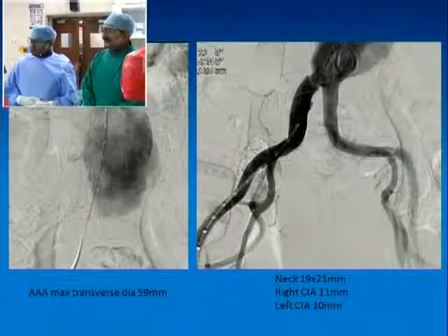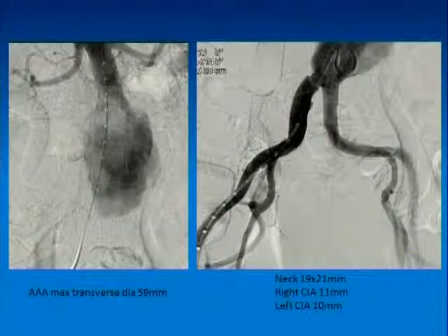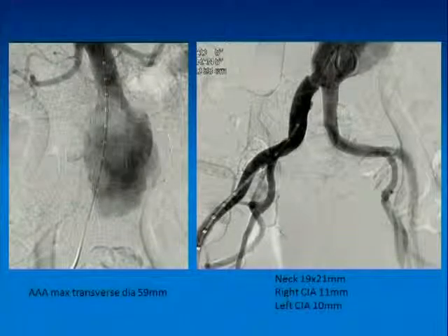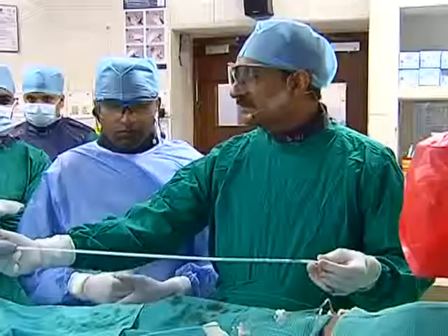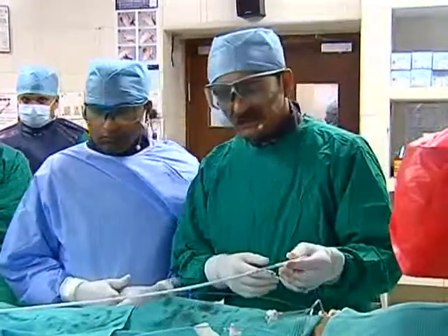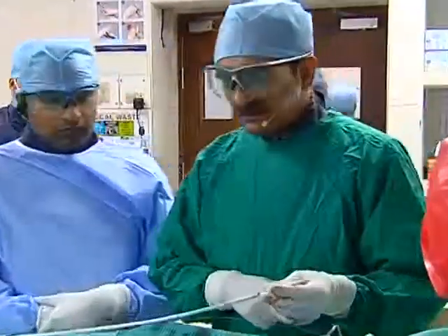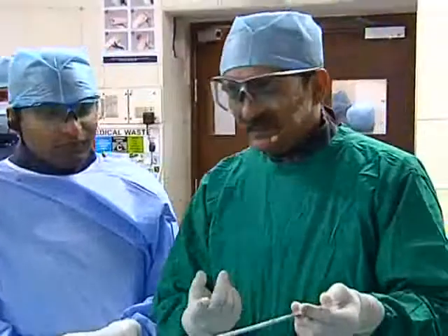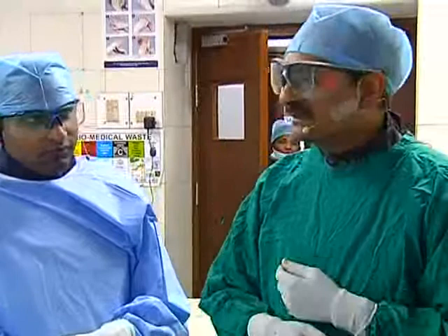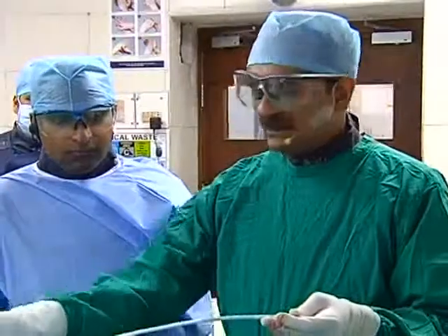And the lower end, which comes into the iliac, the iliacs are around 10 or 11, so we have taken a device that ends as 13. So the device we have selected today, maybe we can bring it onto the table now, is a new version of the Endurant device. It's called the Endurant 2. It's very similar to the old Endurant. Only thing is that they have a wider range of sizes, and also I think the profile is a little lower in some of the sizes. This one is 18 French. 18 French is just 6 millimeters, and his iliac seemed larger than that. So this is what we are going to take for the main aneurysm and the right limb.